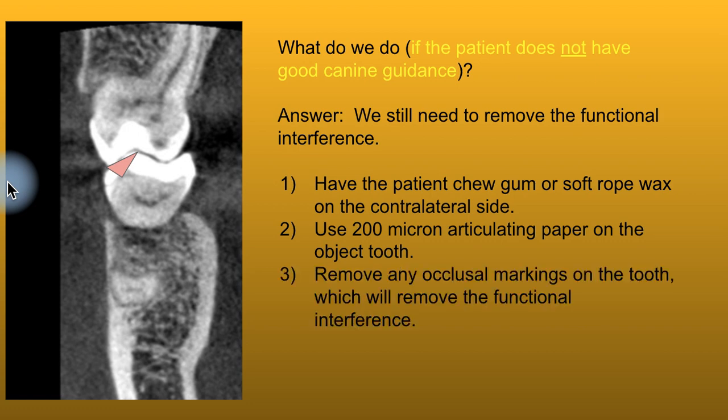So if you do tap, tap, tap, tap and grind, you have to polish off all of those markings to do this. And we'll often do both of these. Sometimes the information is the same. Sometimes the information is different. But I like having both of these tools in the toolbox. When you switch from one to the other, just make sure to remove the occlusal dots because the information on the teeth is different. You can polish those off rather easily.